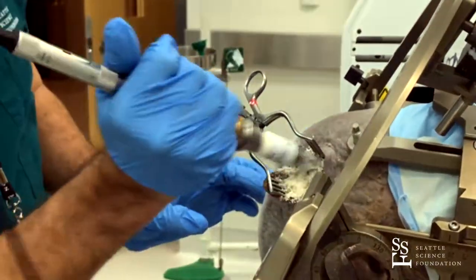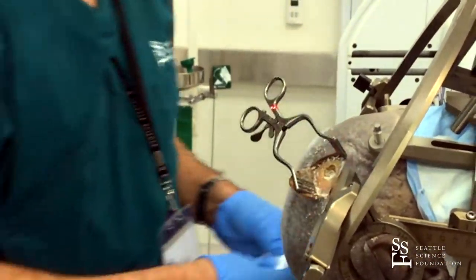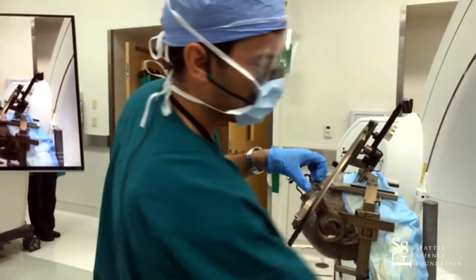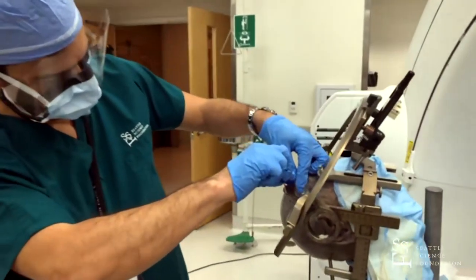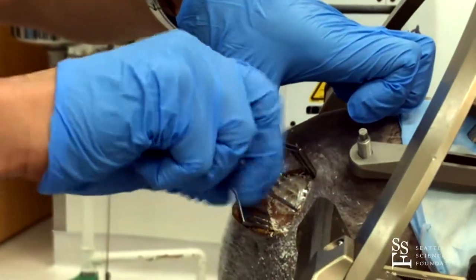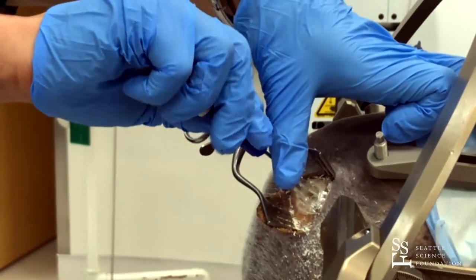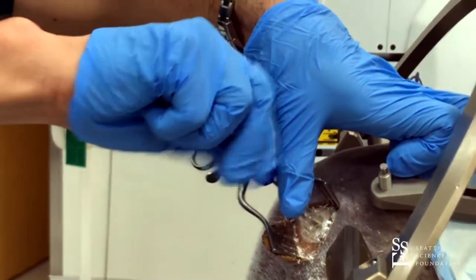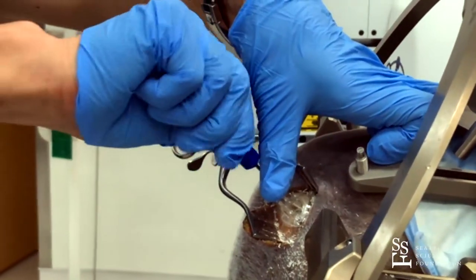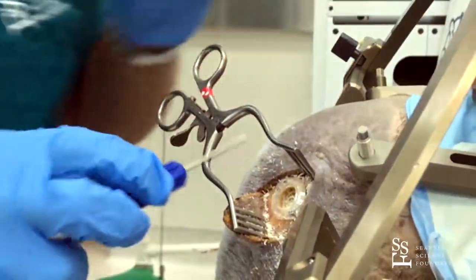If you don't like the smell of bone dust, you shouldn't be a neurosurgeon — I love that smell. This is the skull fixation device that mounts to the skull and will lock the lead in place. Every company has their own name; this one's called the Stimlock. I'll often mark this out with a pencil and then countersink this bump — these are kind of like the DBS horns. If you countersink the skull, the horn will not be as prominent, so that's a little cosmetic step.